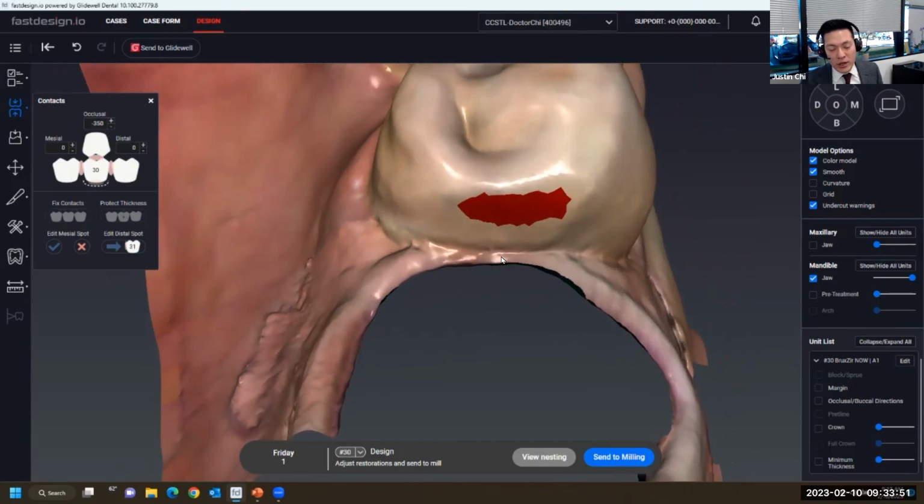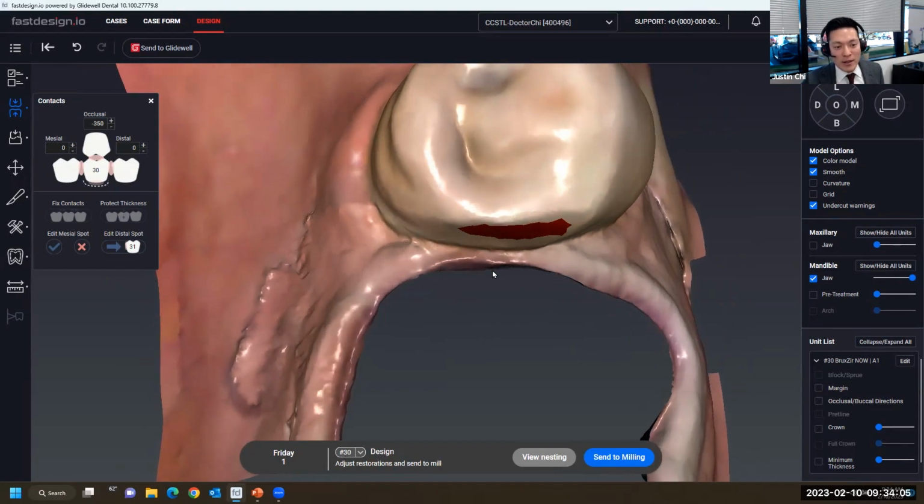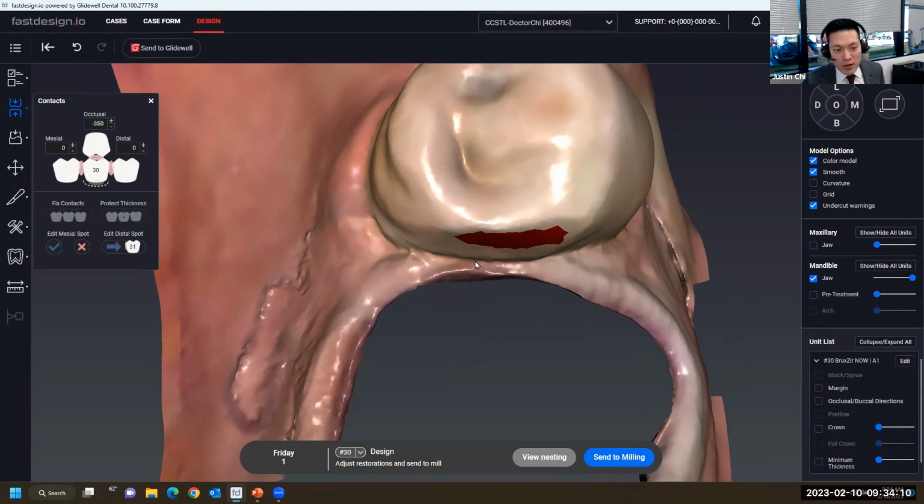And this brings me back to preparation. As you're preparing for a restoration, full coverage, partial coverage, whatever it is, doesn't matter. You want to also verify that you have good surfaces over the adjacent teeth that you can design to. And especially if there are, you know, we've all kind of nicked the adjacent tooth before on preparations. If you did, smooth that out. If there's an irregular surface with a direct restoration, we know how hard it is to get a good contact surface with direct restorations.